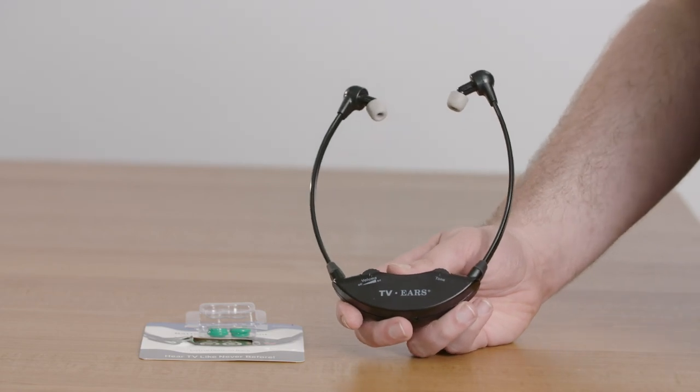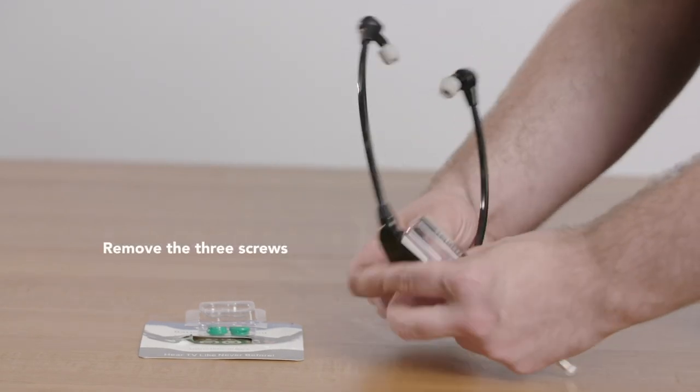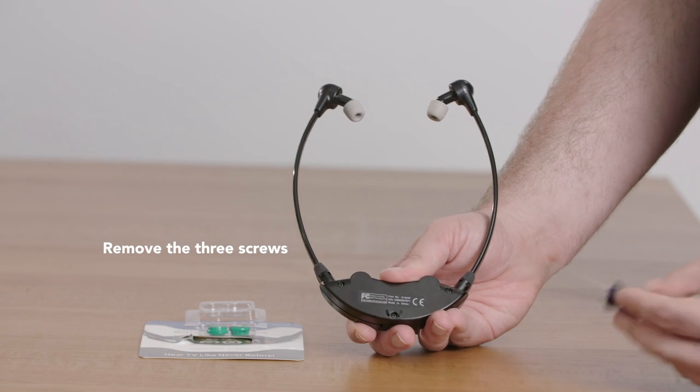To exchange the battery inside the headset, the first thing we'll do is take the screws out of the back of it. You can see there are three screws here.